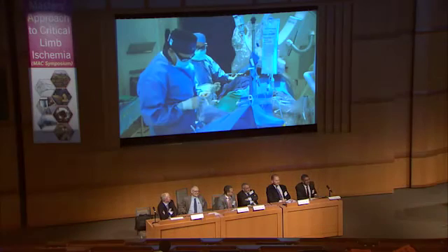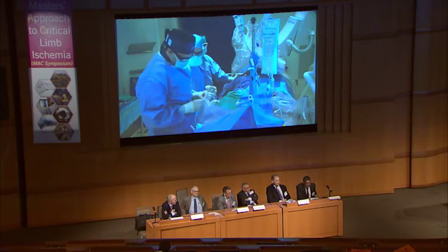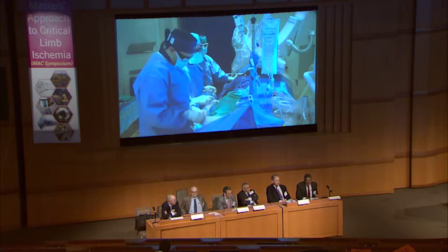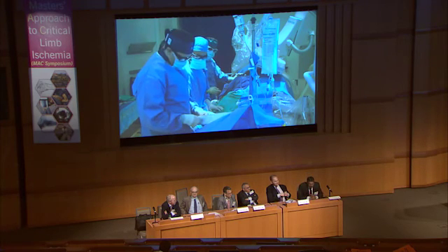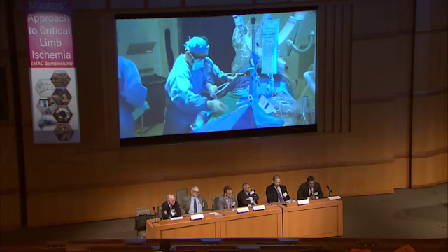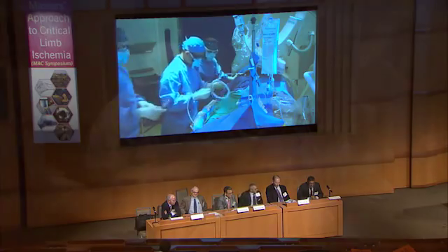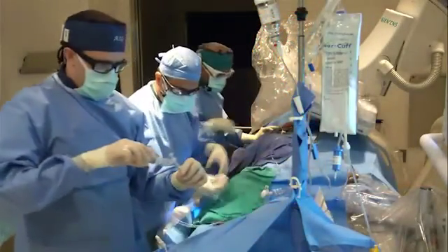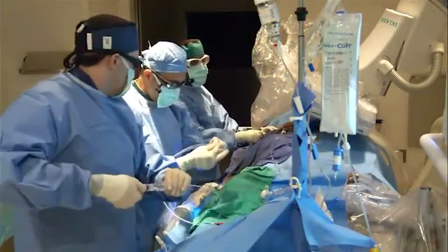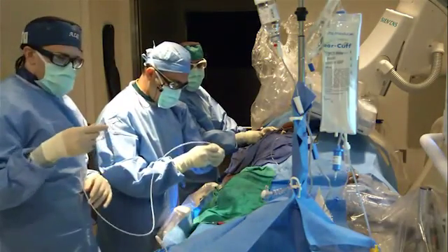Anyone in the audience? I think extending the Viobond, which I initially said should be long, might be the most prudent and time-saving approach here also. So we are all for putting more Viobonds. Mehdi, do you have more? Yes, we actually do have one more. Dr. Leiden keeps us under tight control, but we have a couple left, yes. So we're going to put a Viobond here. We have another 6 by 150.